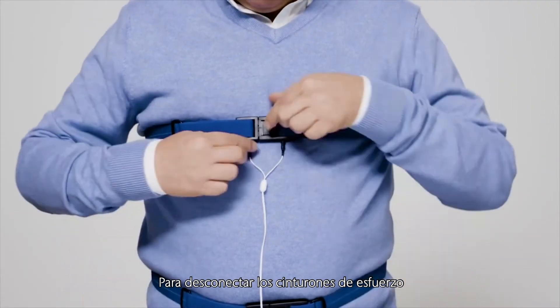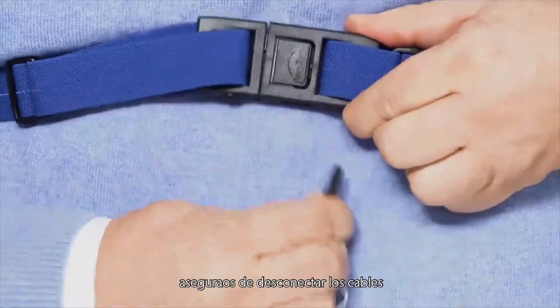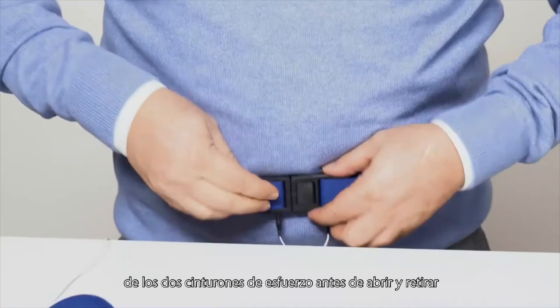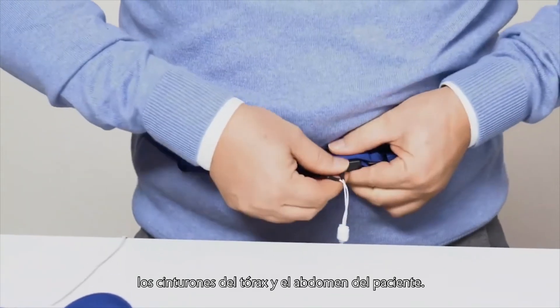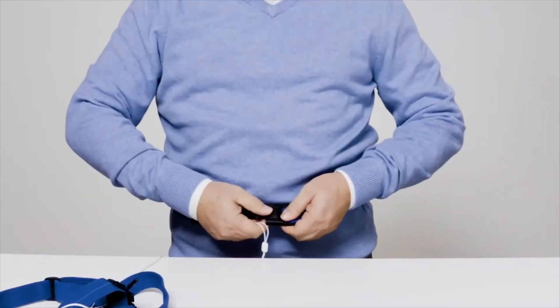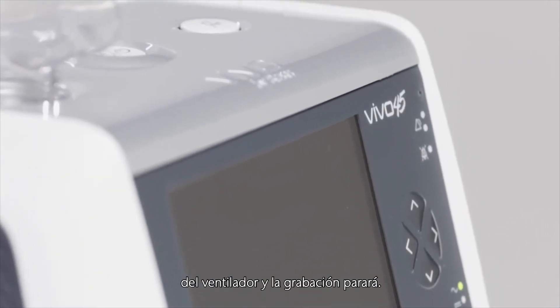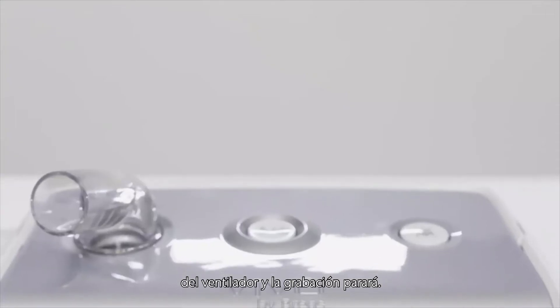To disconnect the effort belts, make sure you always disconnect the wires from both effort belts before you open and remove the effort belts from the patient's thorax and abdomen. Once this is done, you simply unplug the effort belt box from the ventilator and the recording will stop.